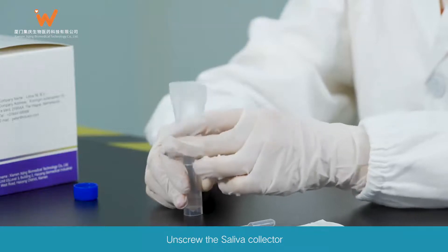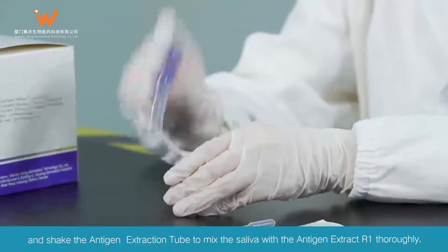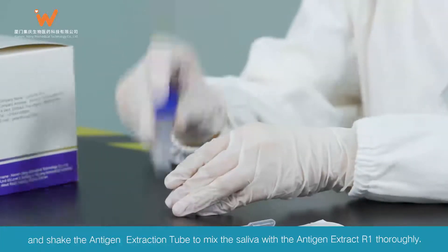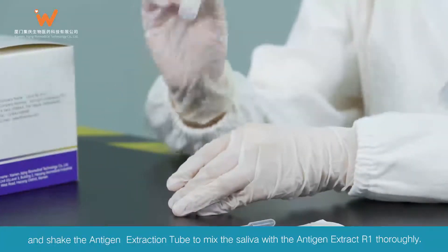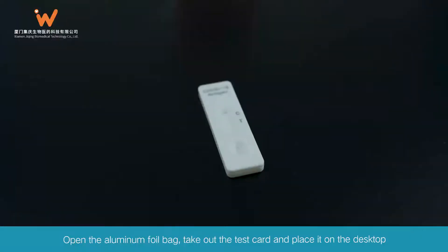Unscrew the saliva collector and close the lid of the antigen extraction tube. Shake the antigen extraction tube to mix the saliva with the antigen extract R1 thoroughly. Open the aluminum foil bag and take out the test card and place it on the desktop.